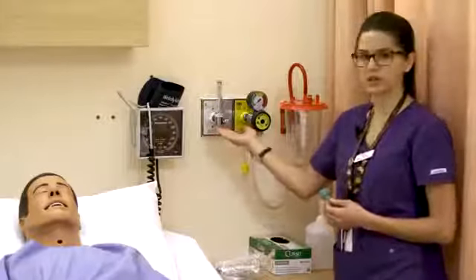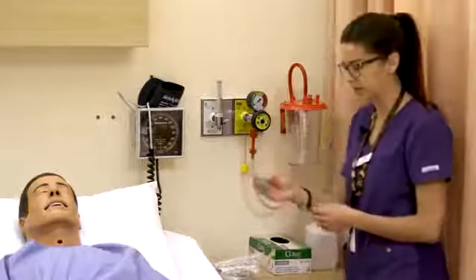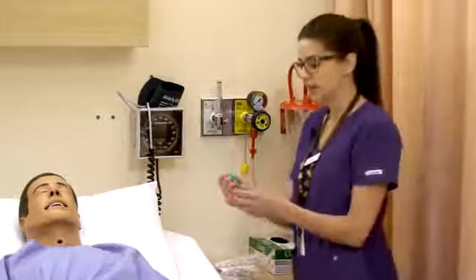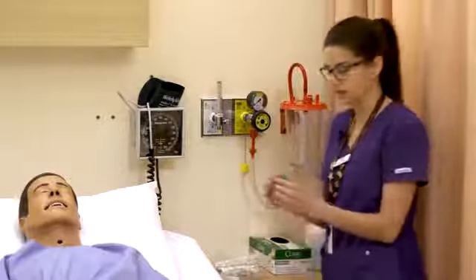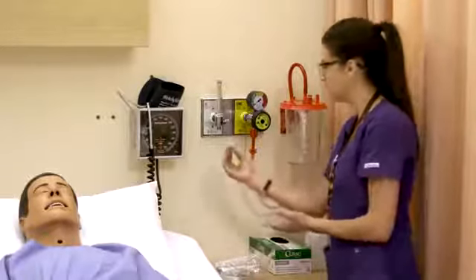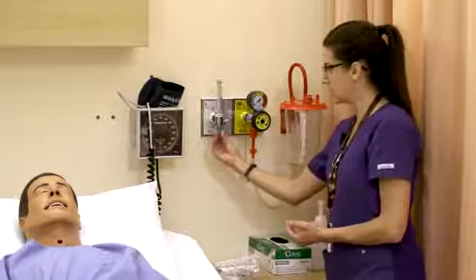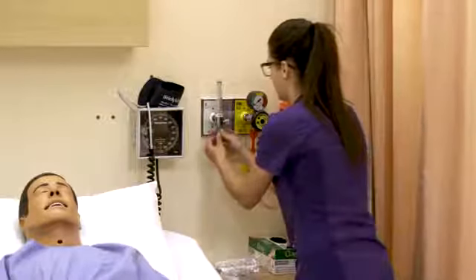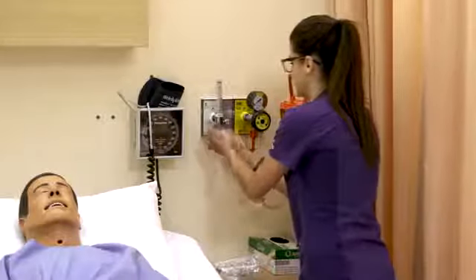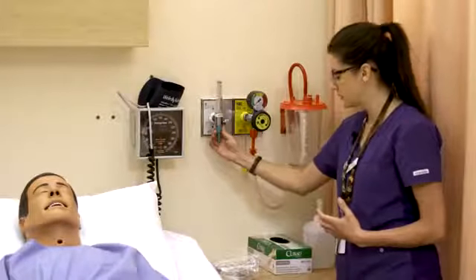As is, this won't deliver a lot of different types of oxygen because they can't connect here. So you need this essential piece called an adapter, or sometimes people call it a Christmas tree because it is often green. There sometimes are white ones too, but oxygen adapter is maybe the better term for it, but it's shaped like a little Christmas tree. It connects onto the bottom of your flow meter in a similar screw-on method. So we're just going to screw that on. You want to make sure it's nice and tight, but not so tight that if someone needs to get it off, they can't. You want it to be secure on there. So it's nice and tight.